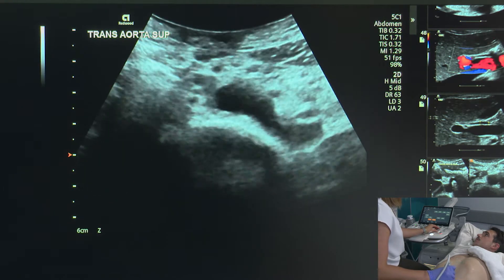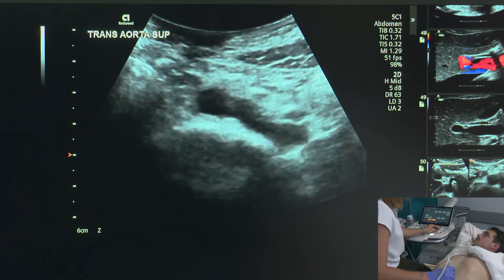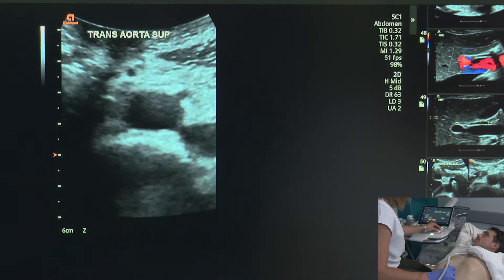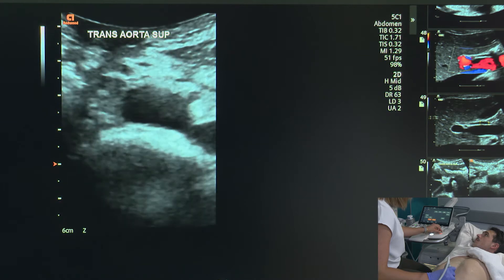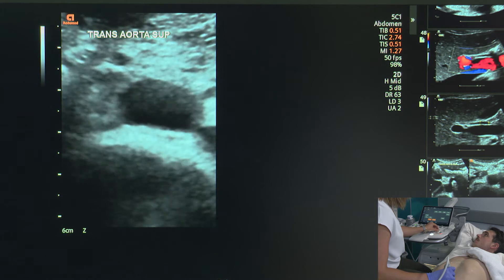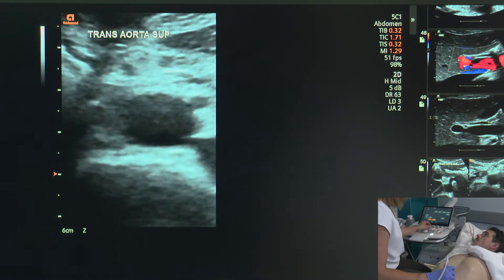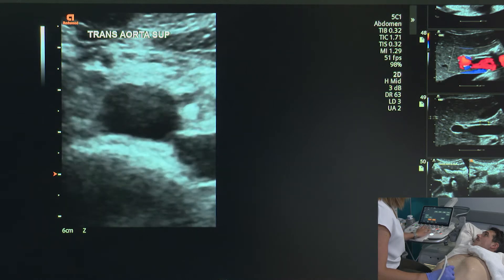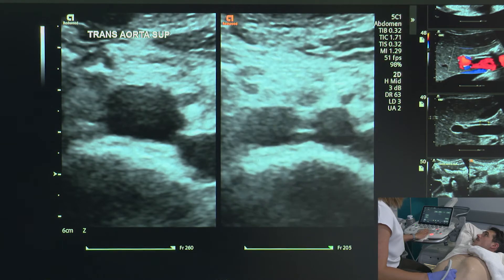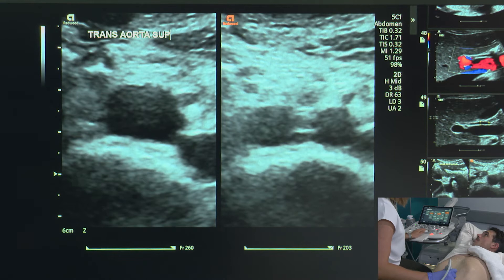As we come down to take our images of distal and bifurcation, we're going to go all the way until we see bifurcation and back up to transverse. We hit dual again, making sure that our focus is set appropriately with zoom. We can now dual and there's our bifurcation. My annotation is going to say trans, aorta, distal, and then we'll type in bifurcation.